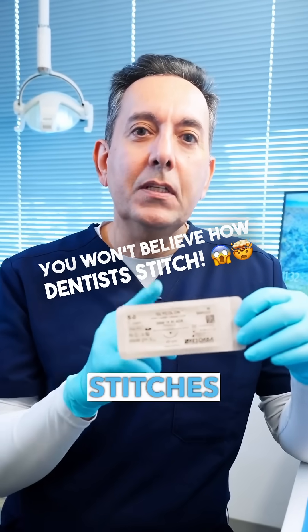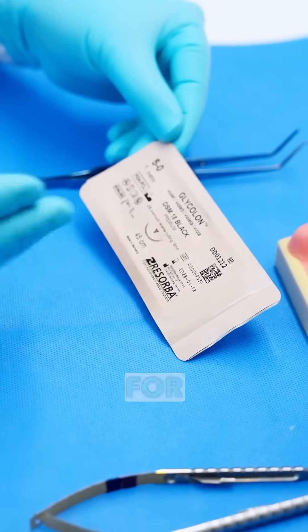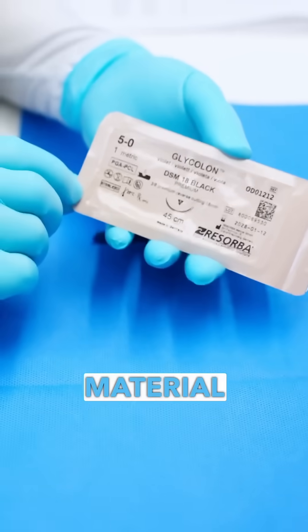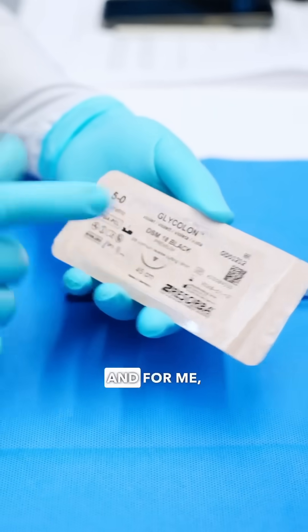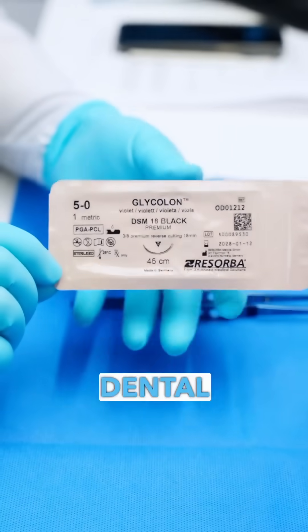If you're curious about how we use stitches to close up wounds in the mouth, let me show you how. The medical term for stitches are sutures, and using the right suture material is extremely important. For me, this is the best suture material that's on the market for dental work.